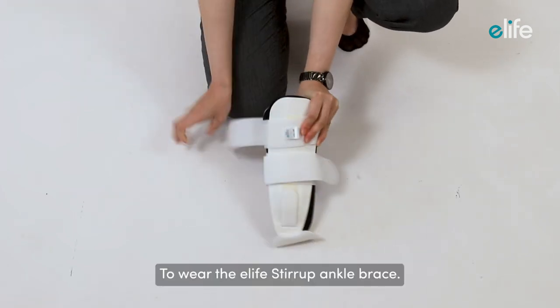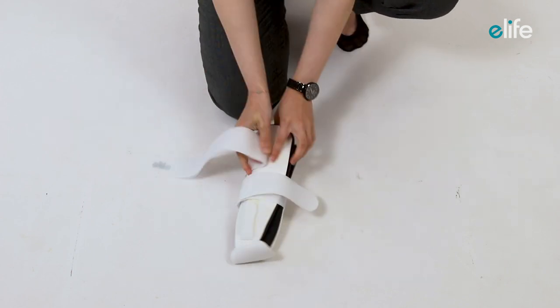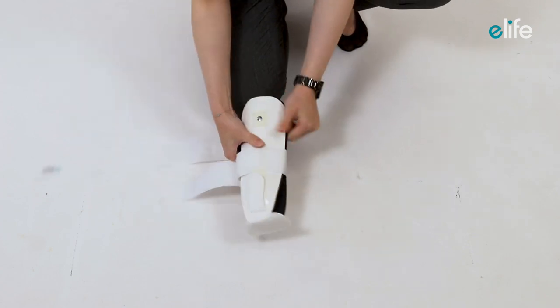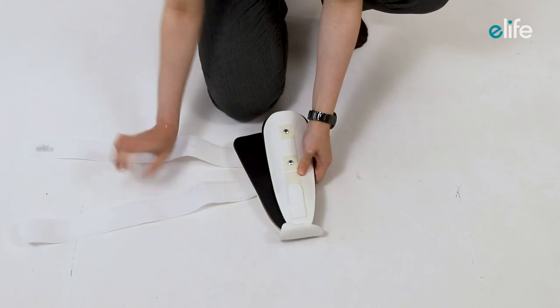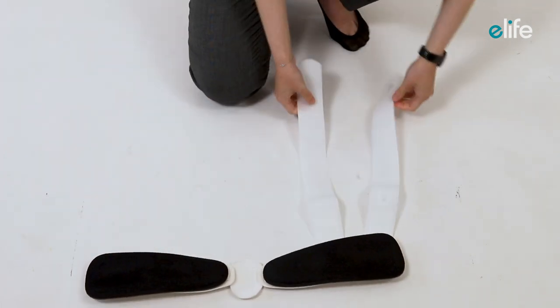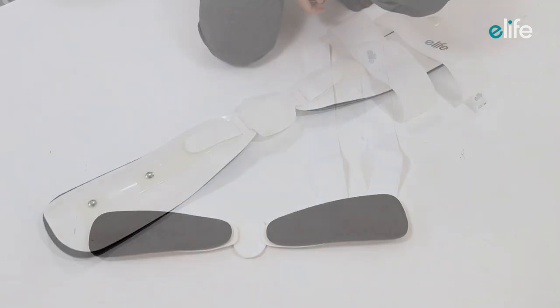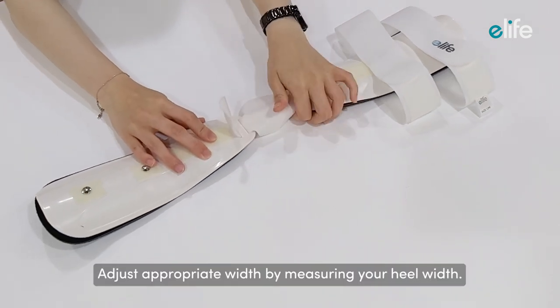To wear the E-Life stirrup ankle brace, first of all, loosen all the hook and loop straps. Adjust the appropriate width by measuring your heel width.